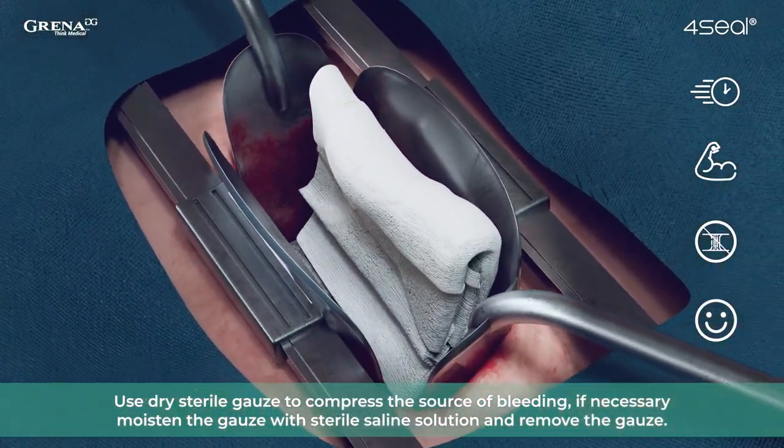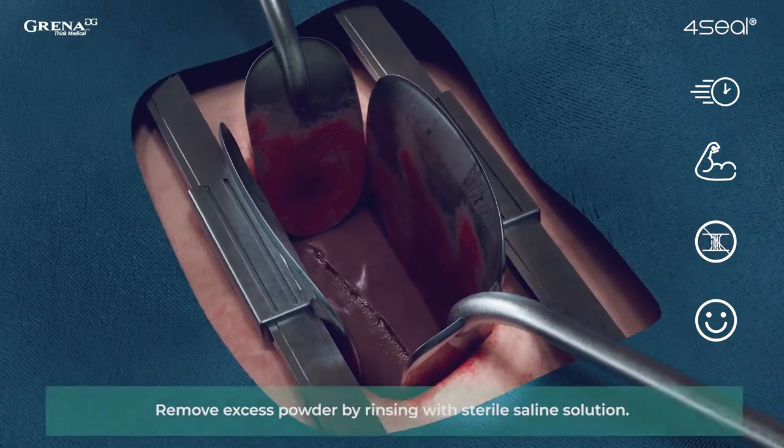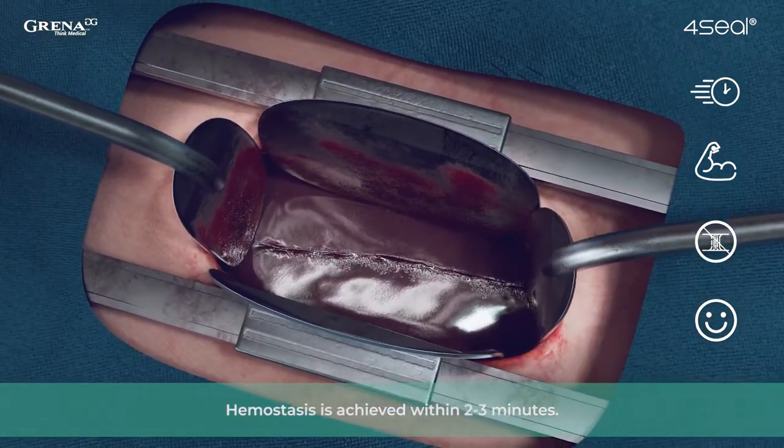Use dry sterile gauze to compress the source of bleeding. If necessary, moisten the gauze with sterile saline solution and remove the gauze. Remove excess powder by rinsing with sterile saline solution.